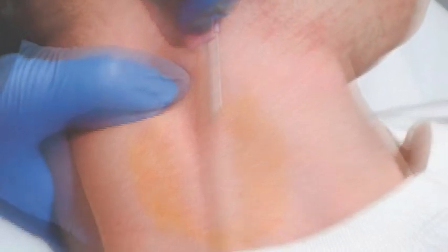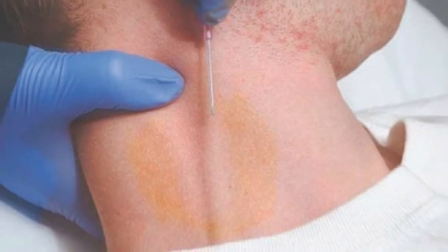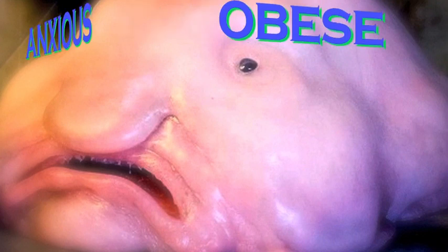It's not such a hard thing to do, but a lot of the educational videos you'll see online feature patient models who are in excellent physical condition, have great anatomical landmarks, and are cooperative. In reality, the patients you're going to be putting EJs in are usually none of those things — they're often obese with terrible landmarks and anxious.